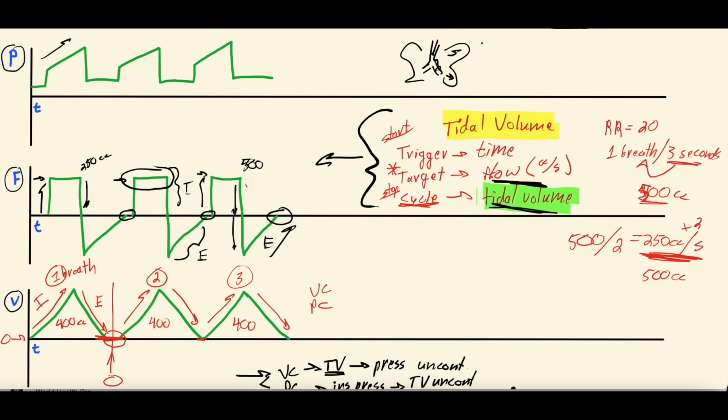But the lungs have a compliance, right? It takes effort to expand those lungs and overcome the lungs' compliance, but that in turn creates pressure pushing back, right? Because those lungs are expanding and kind of pushing back as they expand. And that's what causes the pressure that is created. And peak and plateau pressures and things is going to be a different video.